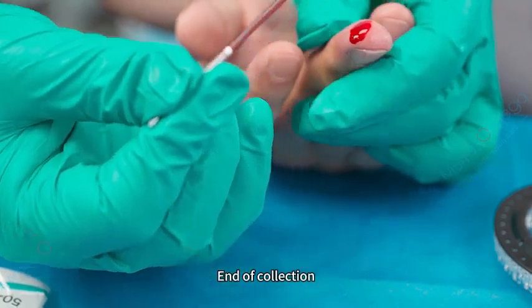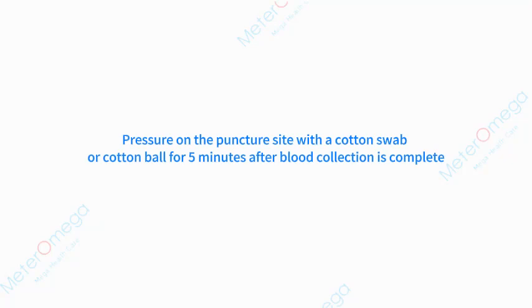End of collection. Apply pressure on the puncture site with a cotton swab or cotton ball for five minutes after blood collection is completed.